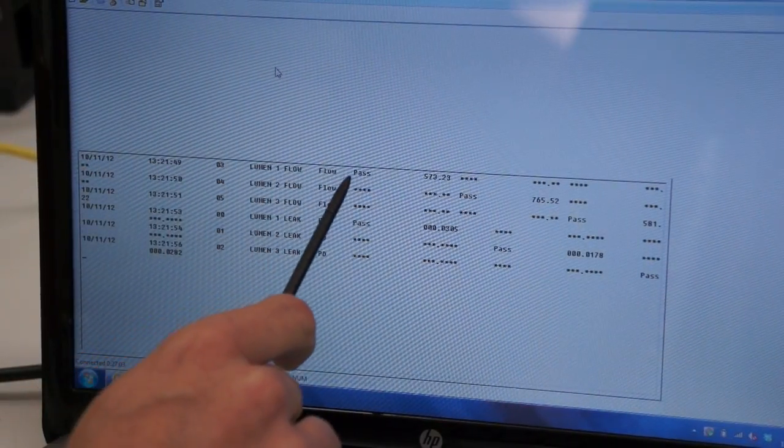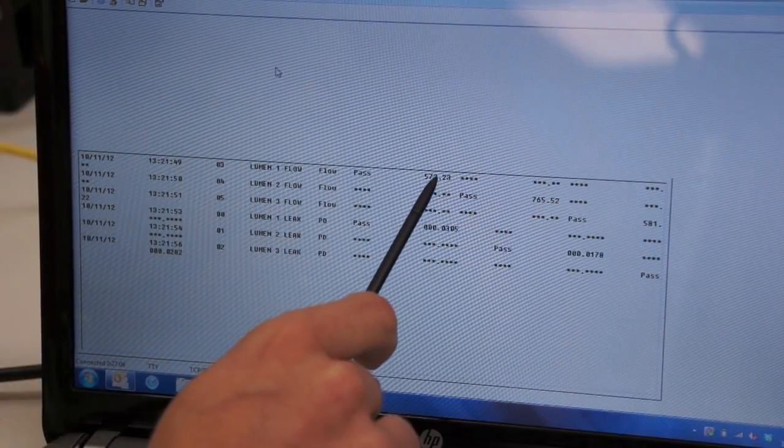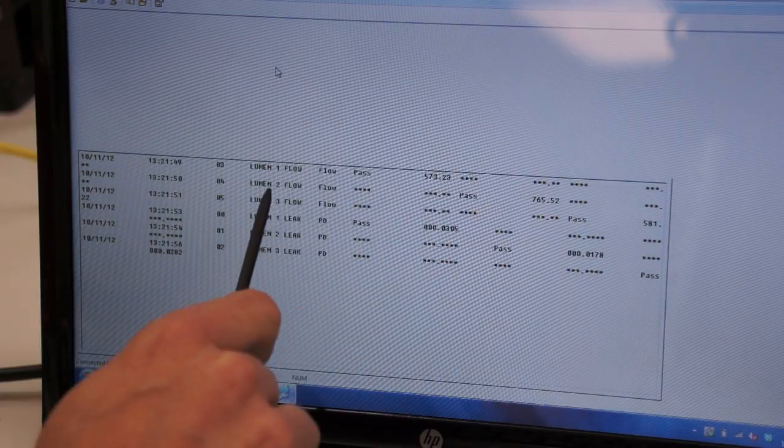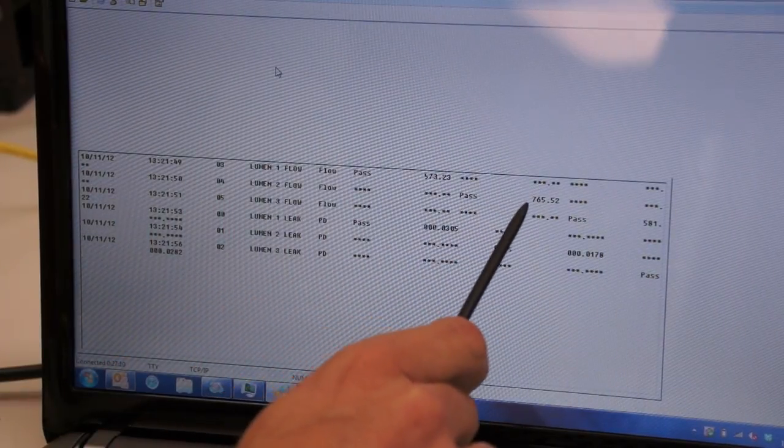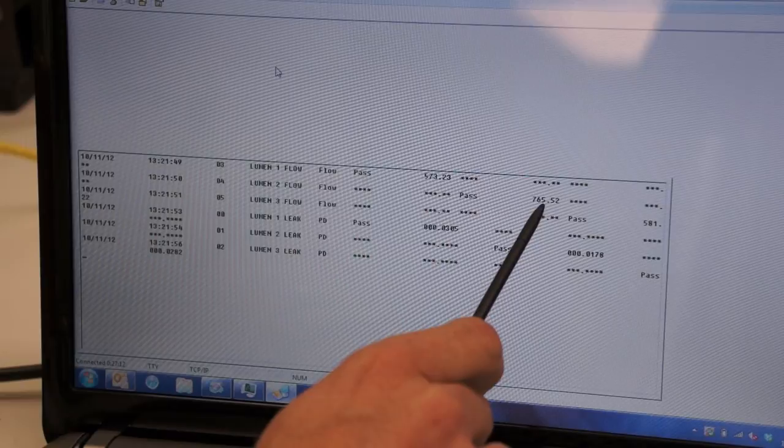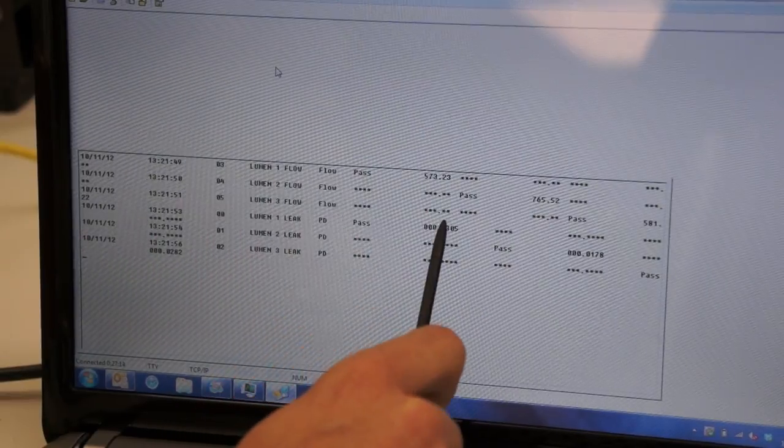Lumen 1 flow was a pass. We recorded 573 cc's. Lumen 2 was a pass. We recorded 765 cc's. Lumen 3 was a pass, and we recorded 581 cc's.